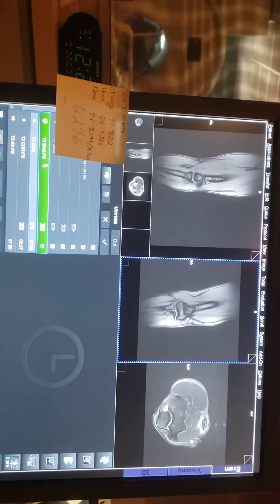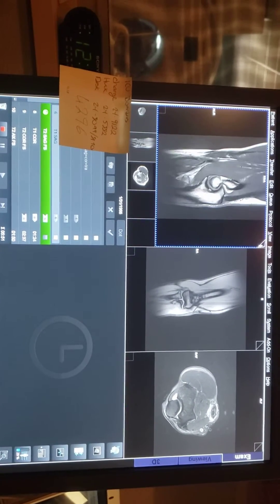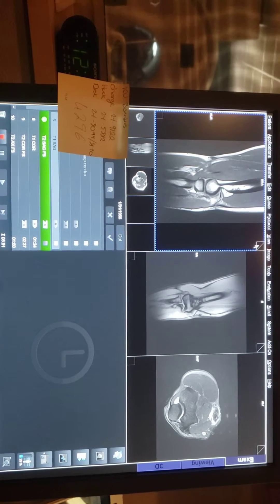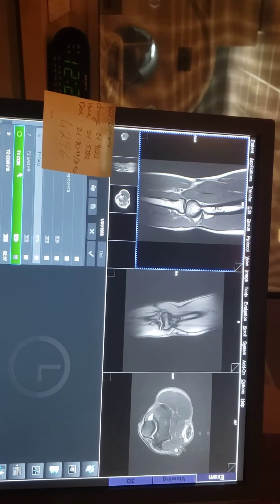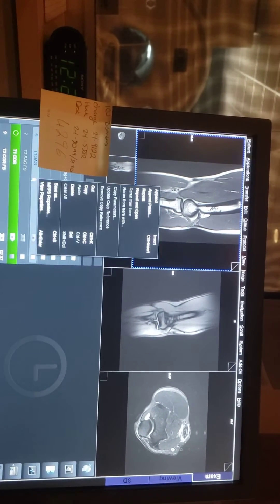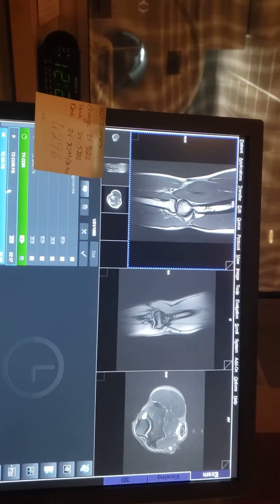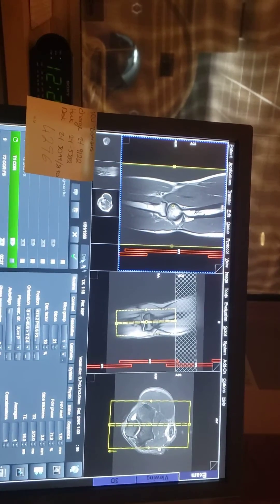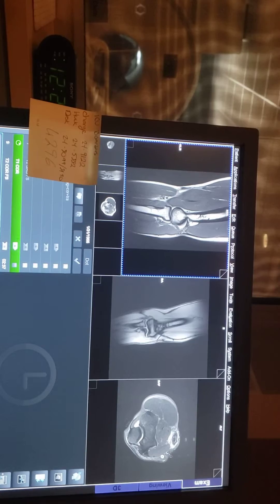And here is my Sagittal. It looks like I don't have enough on the Sagittal — okay, let's go. So this was the Sagittal setup.